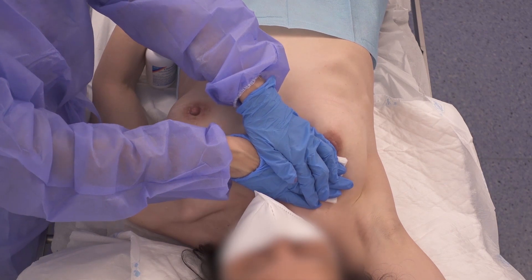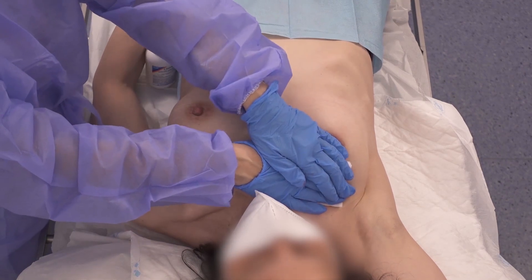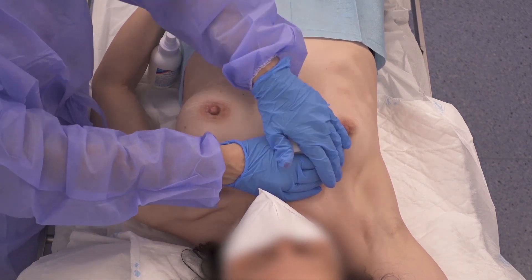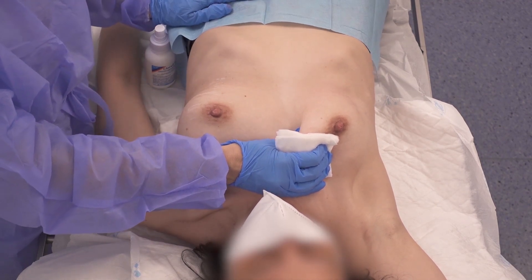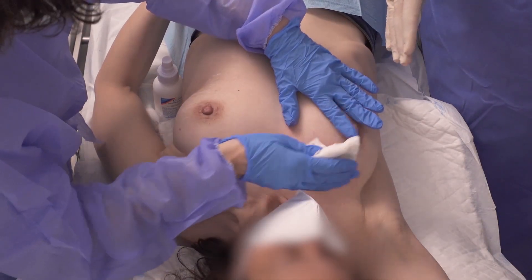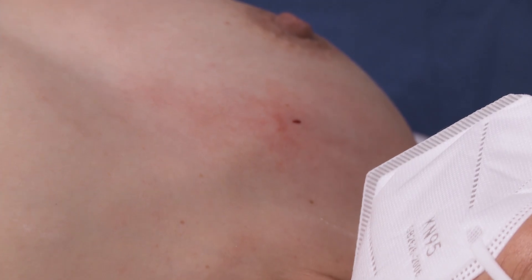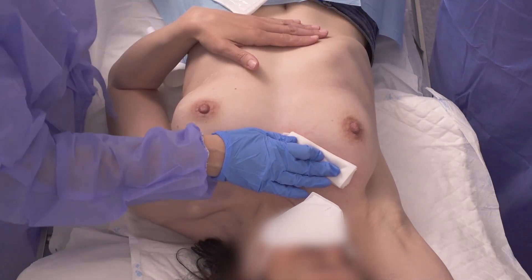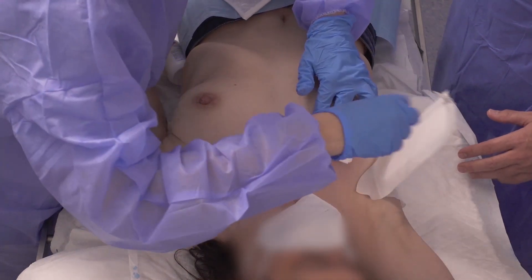To avoid haematoma or any other complications, manual compression and cavity drainage manoeuvres are performed in the biopsy area. A compression bandage that will remain in place for 24 hours is then applied.